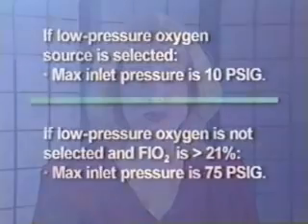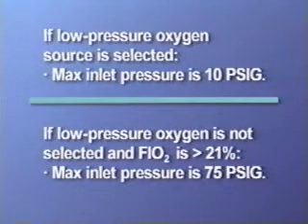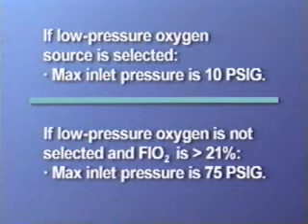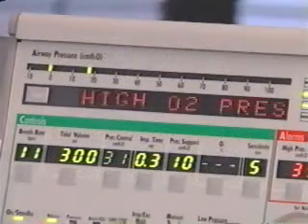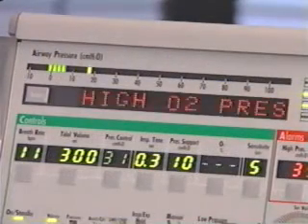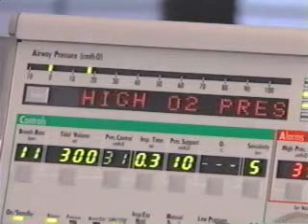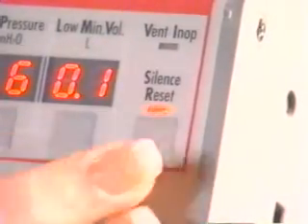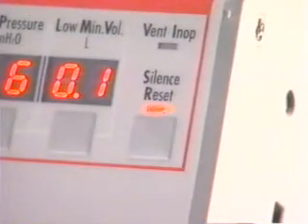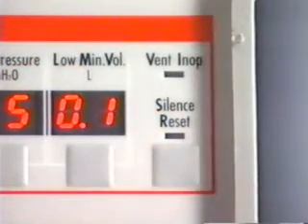The high oxygen pressure alarm occurs when the average oxygen inlet pressure exceeds the acceptable limit for the type of oxygen source being used. If the low pressure oxygen source is selected, the maximum inlet pressure is 10 psig. If the low pressure oxygen source is not selected and the FiO2 is set to greater than 21%, the maximum inlet pressure is 75 psig. When a high pressure oxygen alarm occurs, the high pressure oxygen message is flashed in the display window and the audible alarm is sounded. Press the silence reset button, then press it again to reset the alarm.